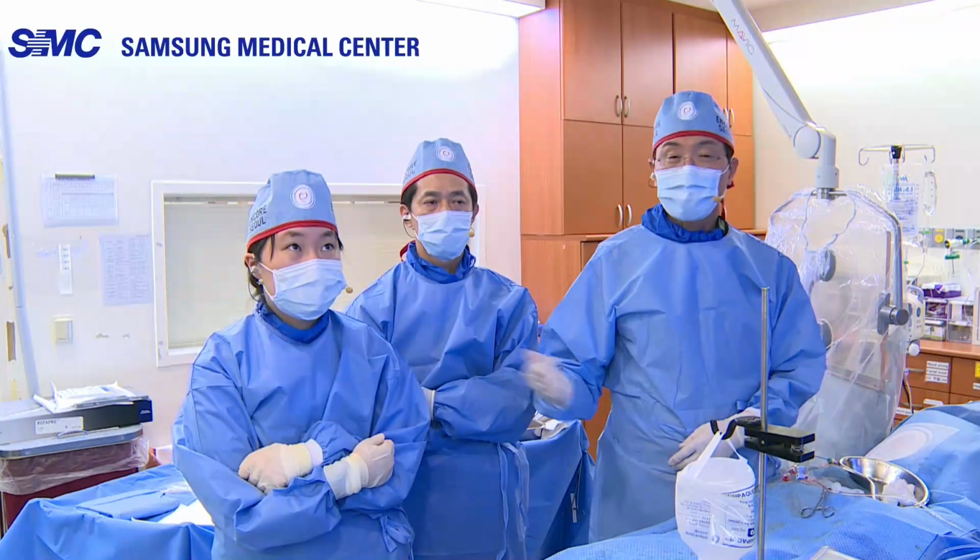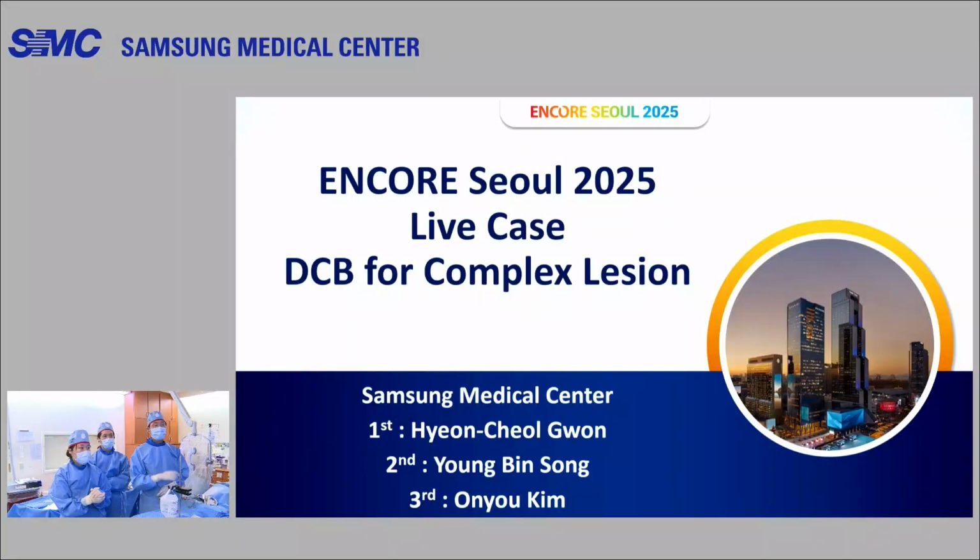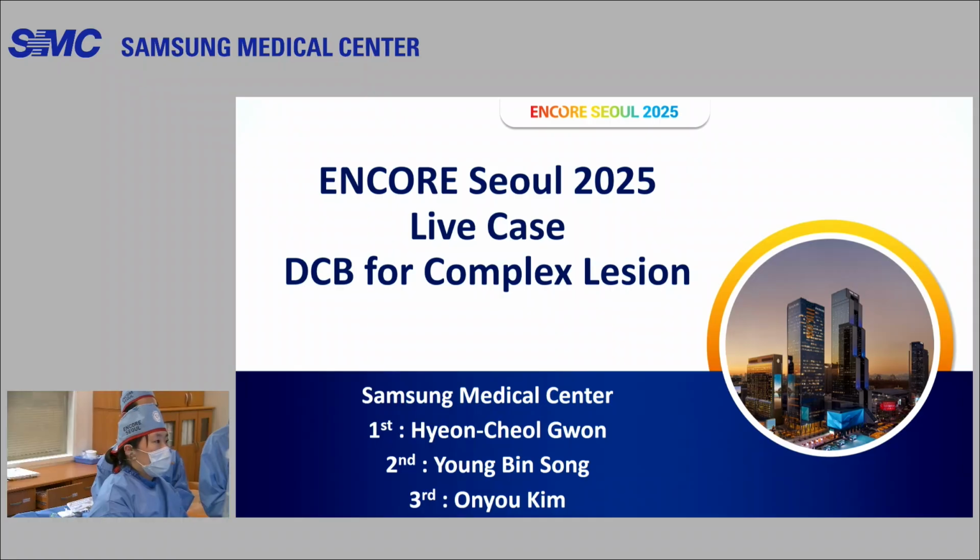Okay, Dr. Kim, can you please present today's case? Good afternoon, everyone. My name is On-Yu Kim. I will present the live case of complex coronary lesion treated with drug-coated balloon. Next.